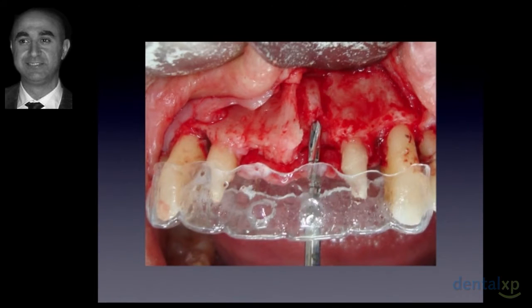After root canaling the laterals and reducing them as it was planned, after extracting the tooth and doing the surgical step, which I'll show right now, is to place a 4-unit CAD-CAM temporary bridge. From the preliminary wax-up, a simple surgical stent is constructed, not to place implants, but just to show you that if I'm passing the pilot drill of the implant that is proposed or anticipated to be placed later on through the palatal aspect of this stent, it is actually out of the bone aspect.